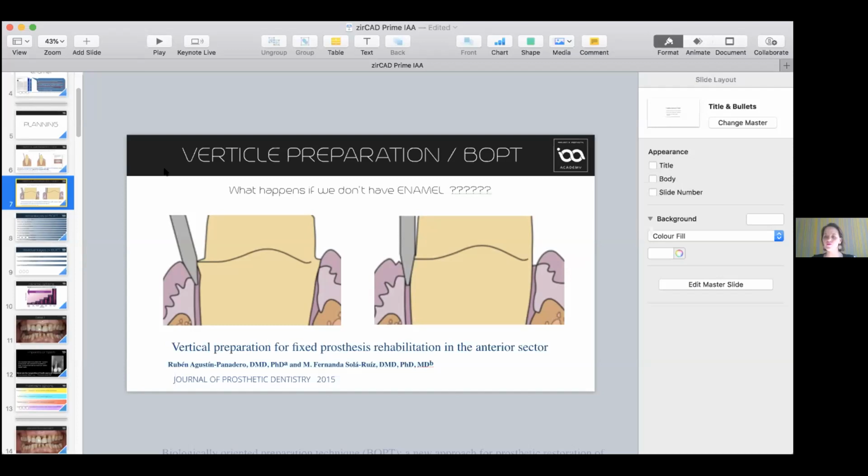The zirconia surface, we would treat first of all with Ivoclean, and then Marcus Blatz wrote a beautiful article on the APC, which is air abrasion, 50 to 60 microns at low pressure, about 2 bar, with a zirconia primer, so Monobond Plus. Then you can use a SpeedCEM, a self-adhesive resin cement. That would be the alternative.